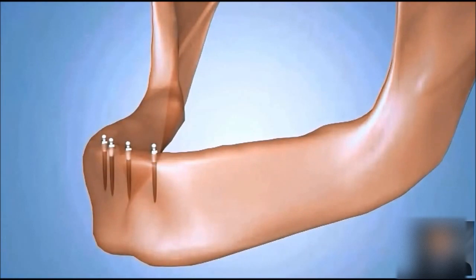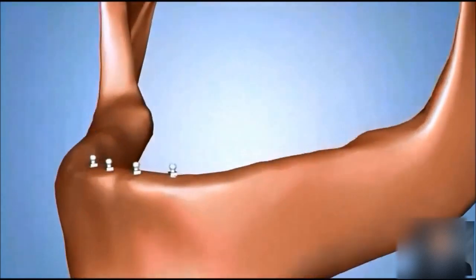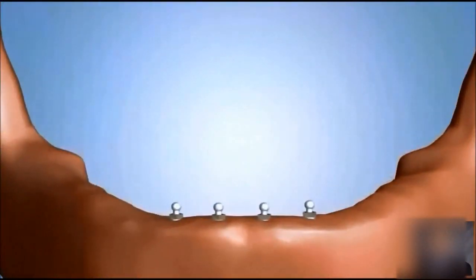The top portions of the implants remain above the gums and are specially designed so that a modified denture can snap securely into place over all the implants.